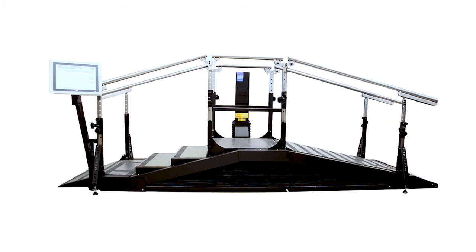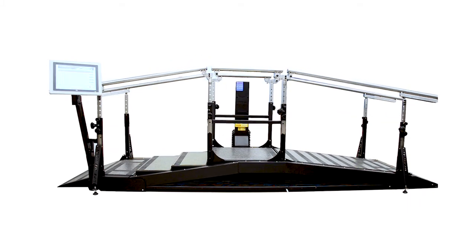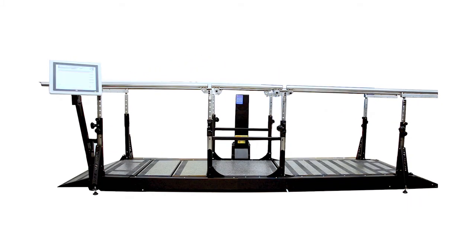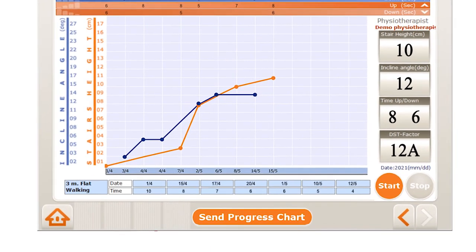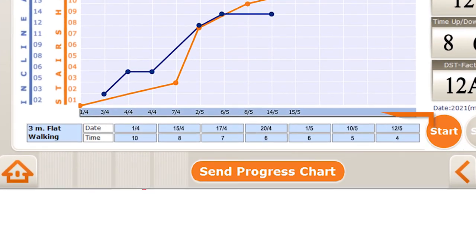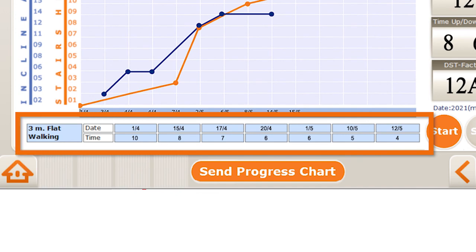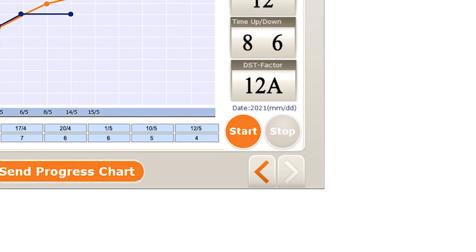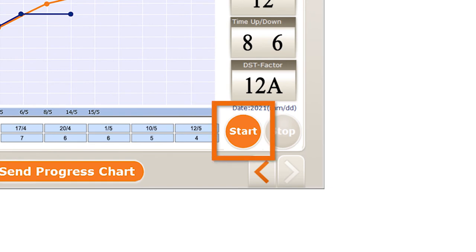In its flat position, the DST is parallel bars — either 1.5 or 3 meters long, depending on your model. Here, you can see how long it took the patient to walk the parallel bars in each session. In order to record the patient's practice, press Start. The recording of the data will automatically stop when the patient exits the device.